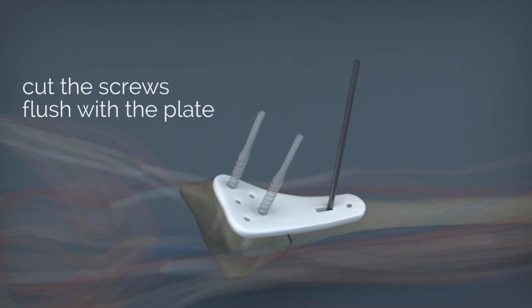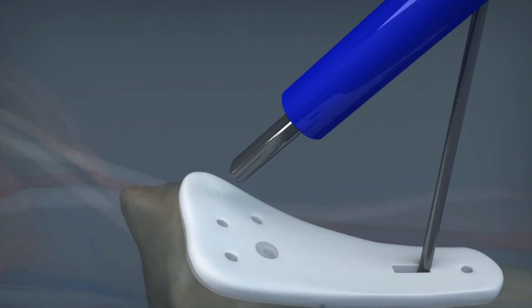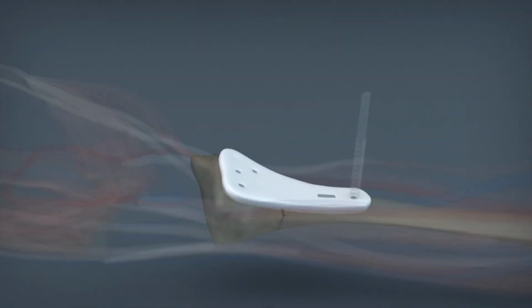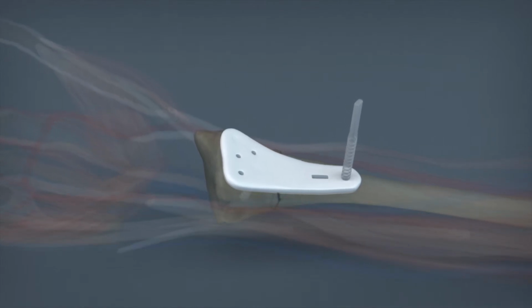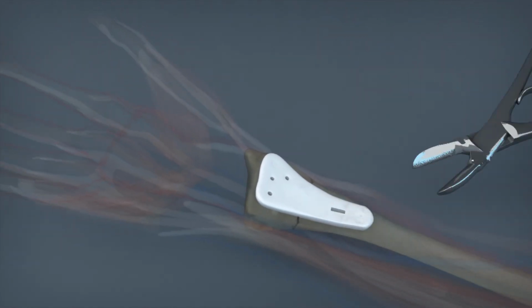When all distal screws are placed, cut the screw flush with the plate using the liston cutter. You can melt the screw and the plate together by using high-frequency unit. This will also smooth the surface of the screw. When distal screws are placed, remove the pin and place proximal screws using the same procedure. Another advantage of the system is to offer to surgeons free placement of additional screws if necessary.